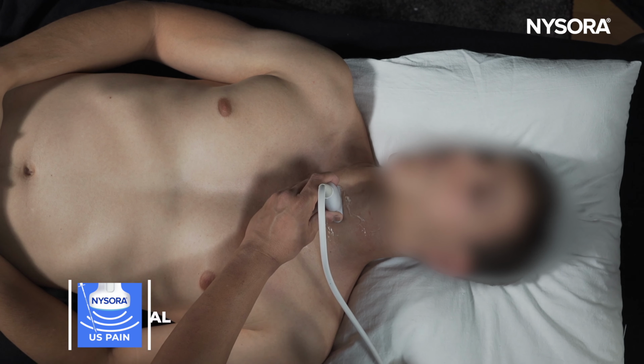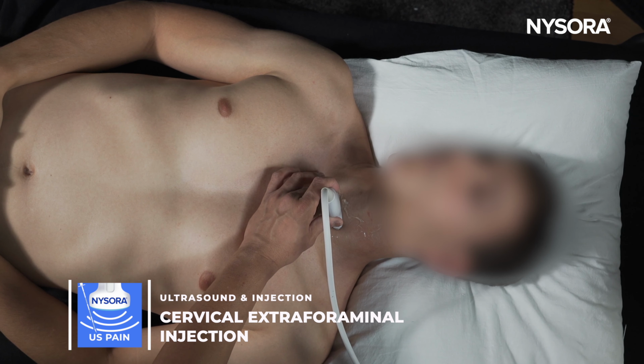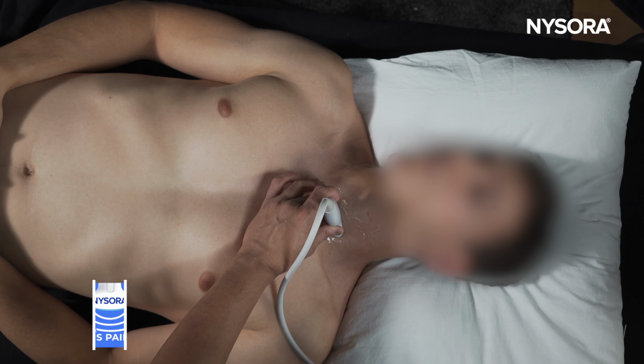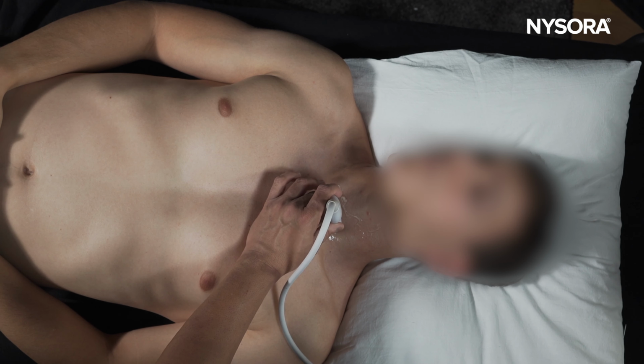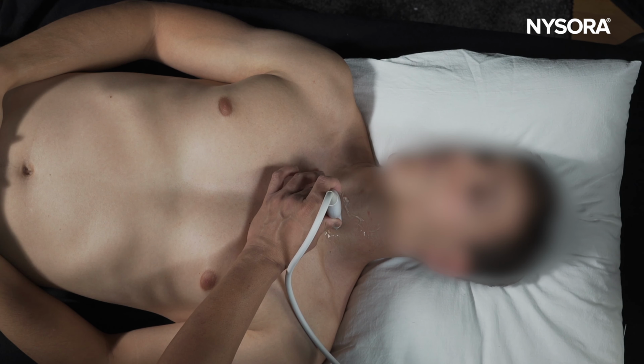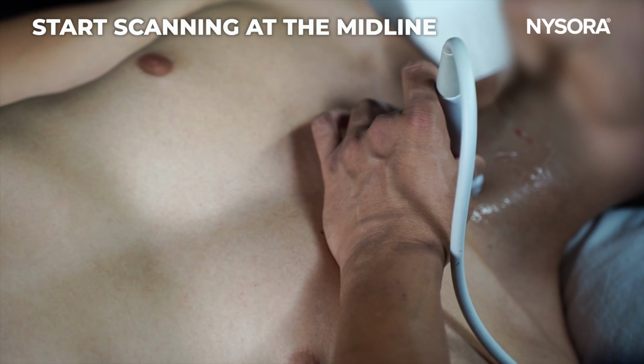So I'm going to show you how to perform the ultrasound-guided extraforaminal injection. When we use ultrasound, we are not doing a transforaminal injection. We are actually staying outside the foramen. That's why it's an extraforaminal injection. Start to scan in the midline in order to know the level.